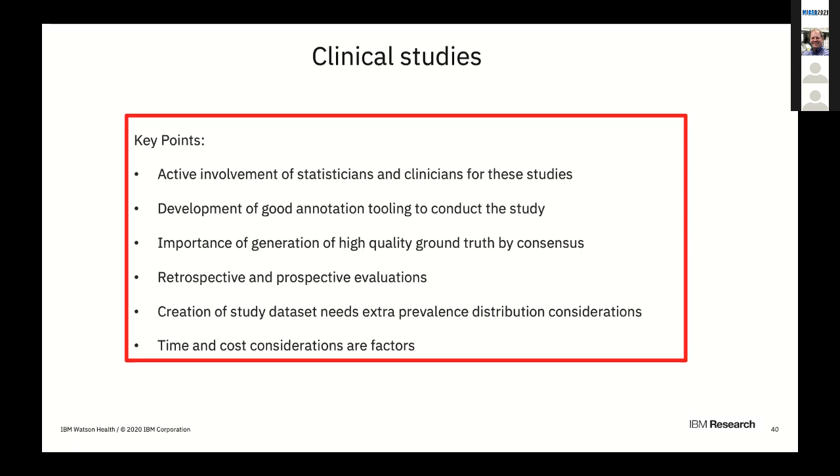In that sense, our evaluation process was split up into radiologist communities. One community developed the ground truth data set, and these are the senior radiologists who did a triple consensus ground truth generation process with adjudication. Then we had a radiologist committee that acted as the attendings, which are the senior radiologists that assist and assess the radiology residents. And then we had radiology residents as representatives of entry-level radiologists that we could compare to, and we used R3 residents as our comparison.